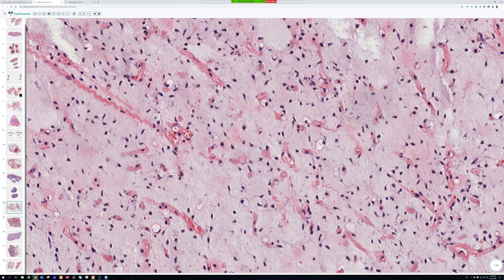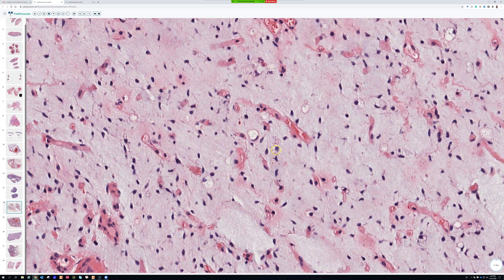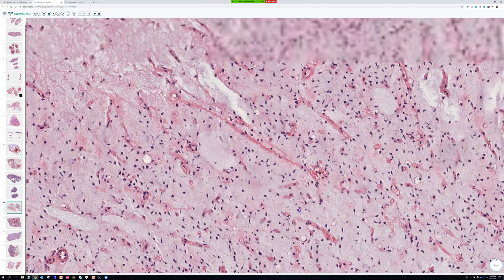This tumor is recapitulating what fetal fat looks like during fat development in the fetus. Fat in embryology starts out as a spindle precursor to adipocytes, then builds up a little lipid and makes a vacuole, and then can make more vacuoles, eventually growing into a full mature fat cell. You can see multivacuolated adipocyte lipoblasts here. I've seen cases where they were very few, absent, or just little signet ring cells — so don't worry if you don't find lipoblasts.